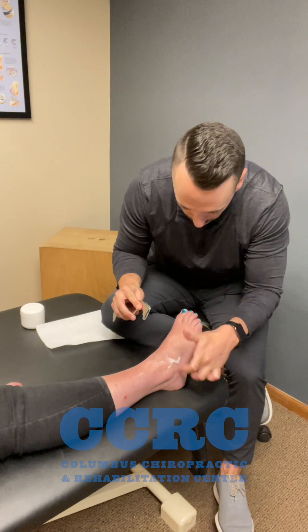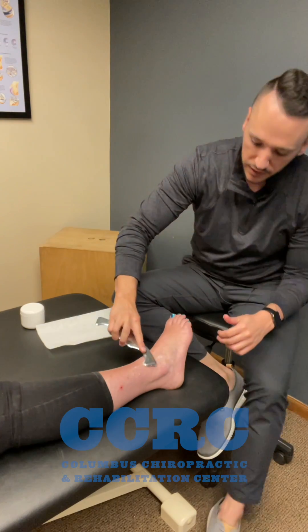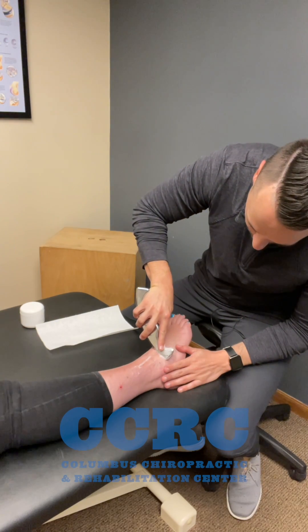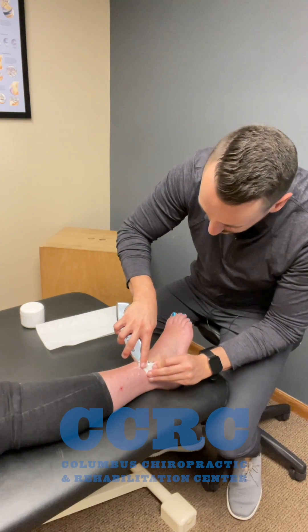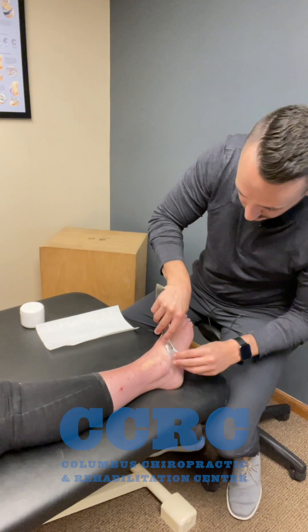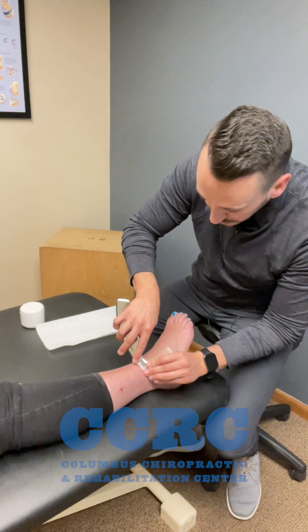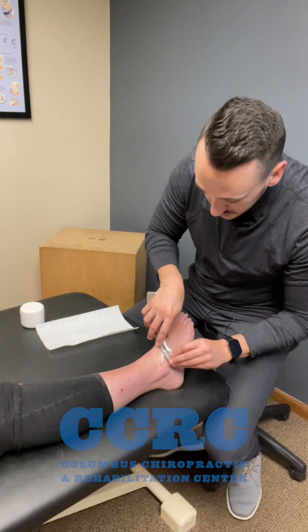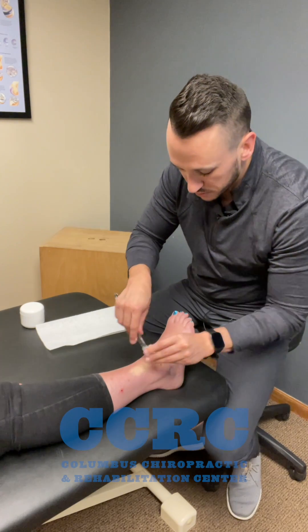Let's say she's got some pockets of swelling down here. What we begin to do — I'm going to start lighter and then build in my pressure as I go. So I am working my way up, literally pushing the fluid up and out of the ankle, starting out light, just as if I'm slowly massaging it up and out. I could use my hands to do this as well, but I find that with a tool like this I can get a slightly deeper penetration of the tissue, and it saves my hands as well, which is nice.